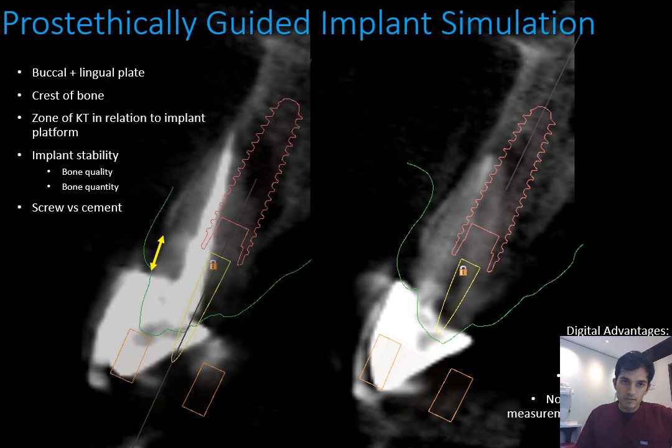So, a closer view of this prosthetically guided implant simulation. There are different things you want to look out for here. And first and foremost, I want to show you how an intraoral scan can help you simply with your planning.